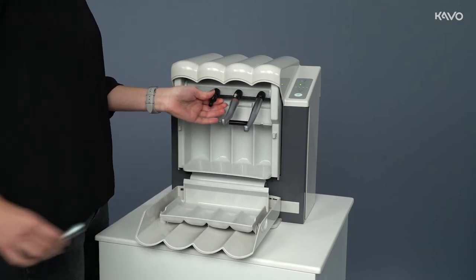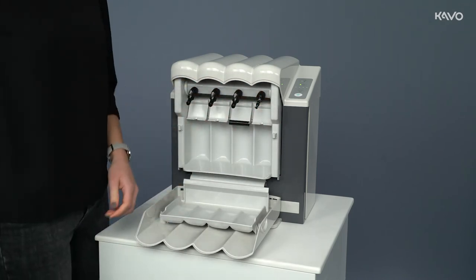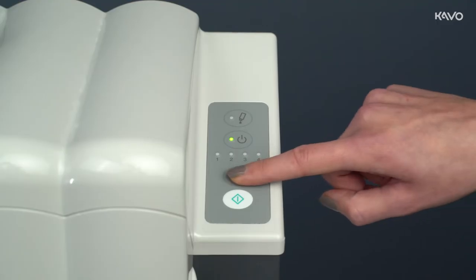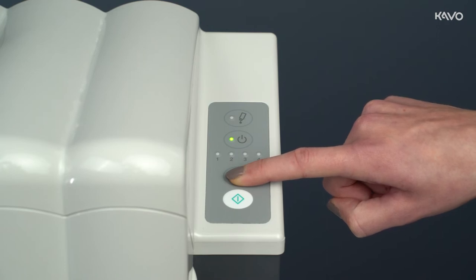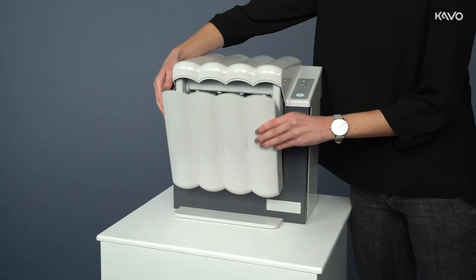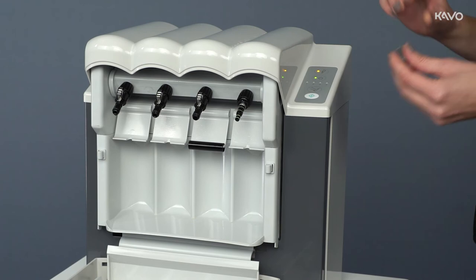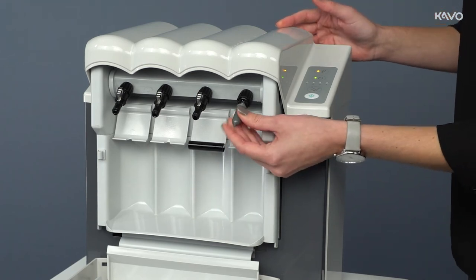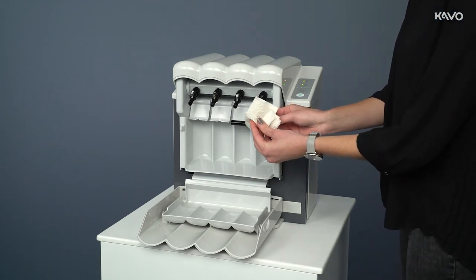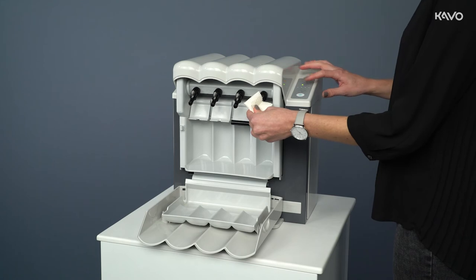In addition to classic instrument care, the QuattroCare Plus also has a collet chuck care program. This feature should be utilized once a week. To carry out the collet chuck maintenance, the front cap must be closed and the collet chuck maintenance button pressed for at least three seconds. The spray container control LED flashes three times once the mode is active. Now remove the collet chuck care maintenance attachment and place it on the multi-flex adapter at maintenance location 4. Cover the head of the instrument to be serviced with a kitchen towel to avoid contaminating the surrounding area. Then press the instrument collet chuck against the tip of the maintenance attachment and press the collet chuck maintenance button.